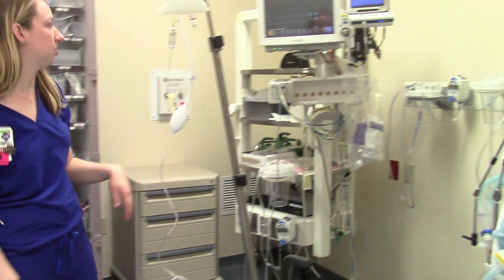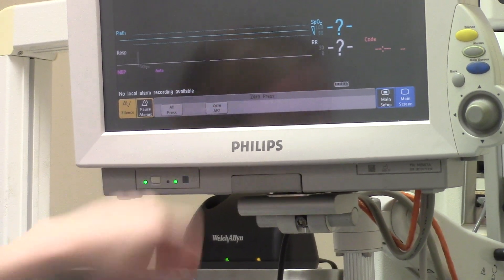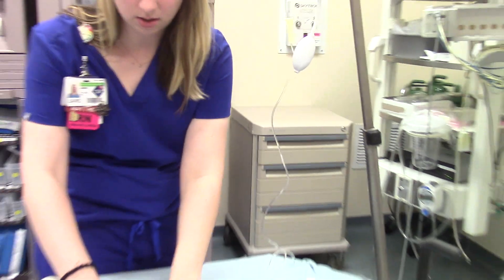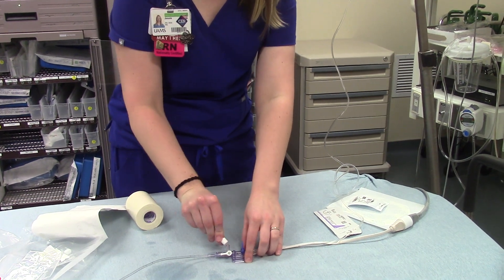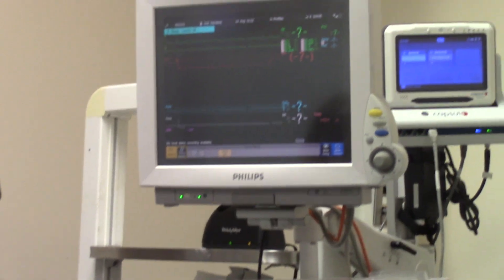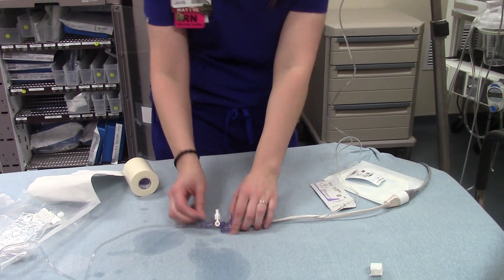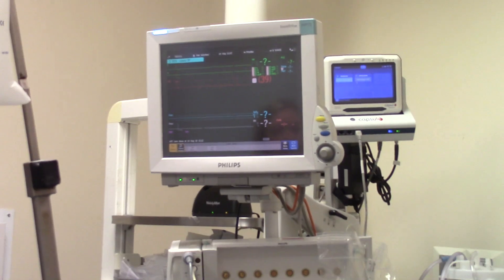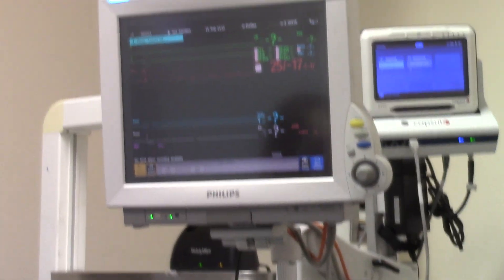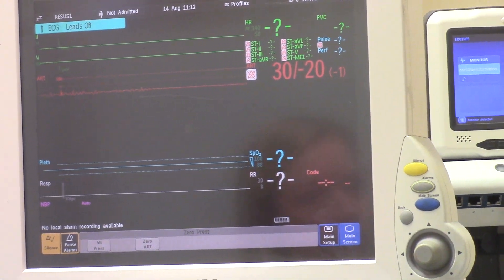Once you have the transducer on the patient's chest and everything's hooked up, you'll need to zero your art line. It really helps to have a second person to do this. Hit zero on the monitor, then hit zero art. What you'll do is flip this off to the patient — turn the stopcock off to the patient side. Open it to air, and then you're going to get zero. Wait for it to beep a second time. Once it beeps a second time, you're zeroed. Go ahead and put this back on and make sure you open it back up to the patient-side valve.